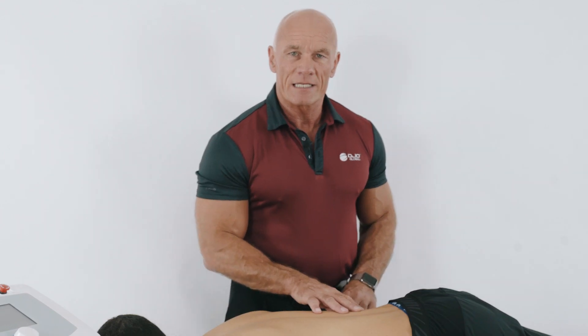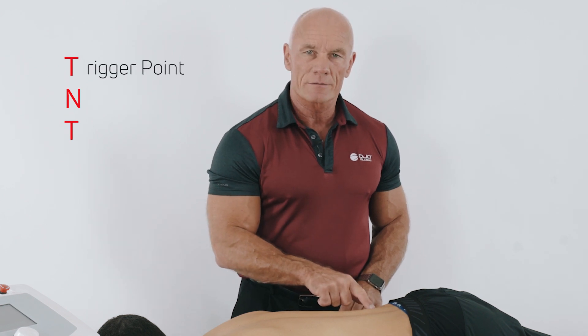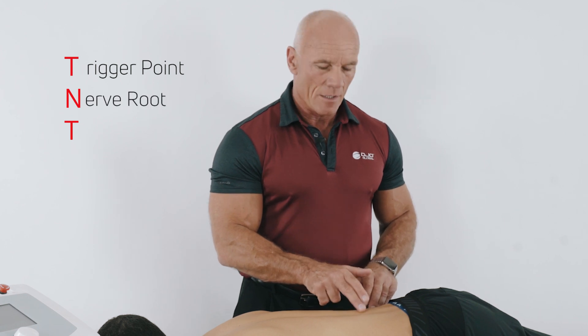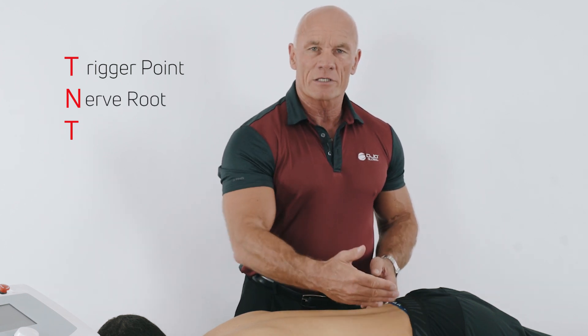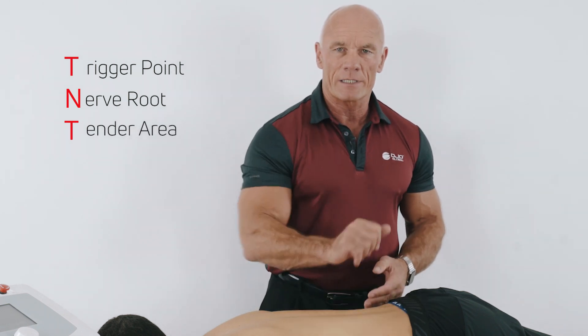We use the same technique, the same protocol of TNT. We're going to treat the trigger point. If there was a neuropathy, we treat the nerve root. But it's also important then to go on and treat the tender area. So let's see how we start.